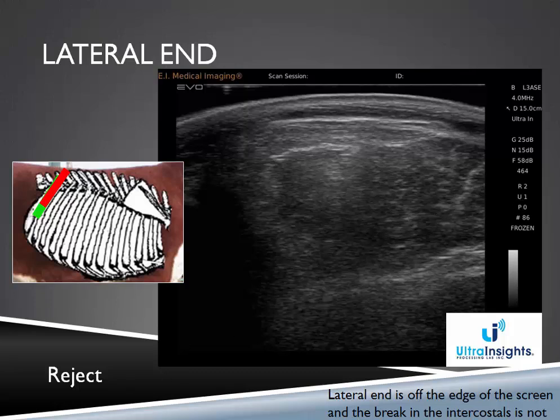So hopefully that kind of gives you just some real basics on image quality, and that probe placement plays a role in what the image looks like and then what we can do with the image and whether we can process it.